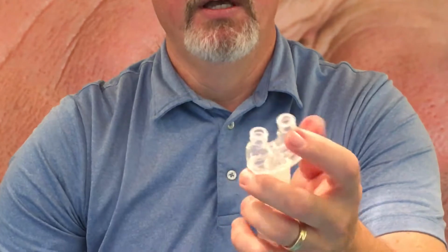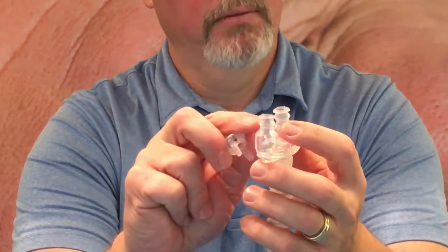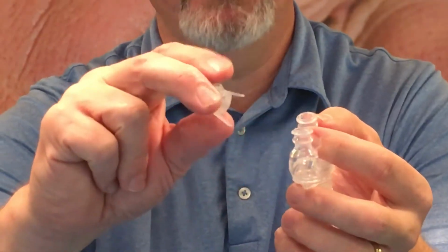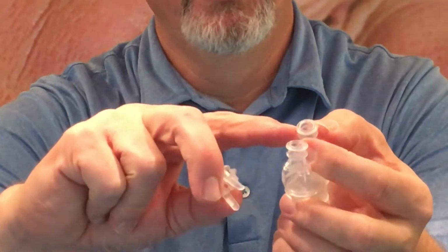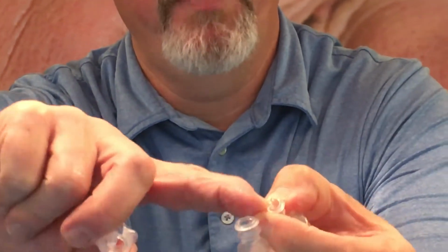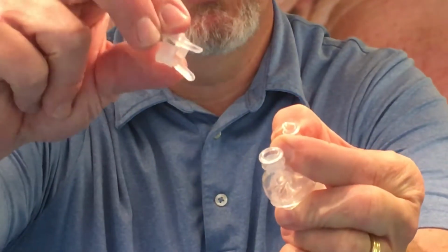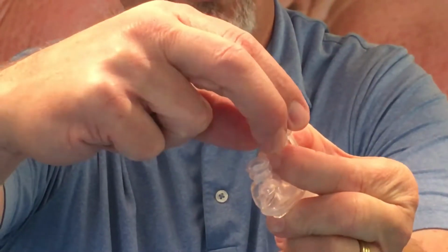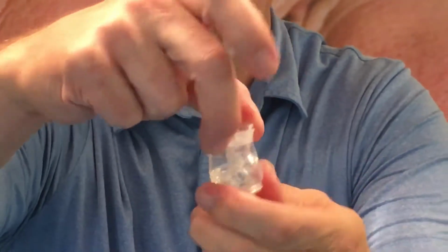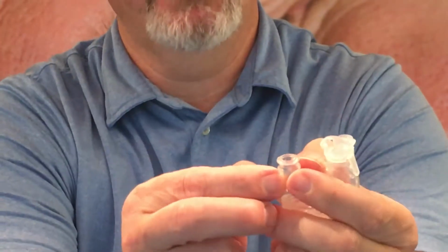Very simple. The most critical element to proper alignment with the silicone is making sure that the silicone base is inside the QR socket. The easiest way to do this is to indent with one finger, pinch with your other thumb and index finger, slip the QR socket over the top of the silicone, and then release it, give it a twist, and you'll see the QR socket is back into place. And then you can duplicate that with the other side.